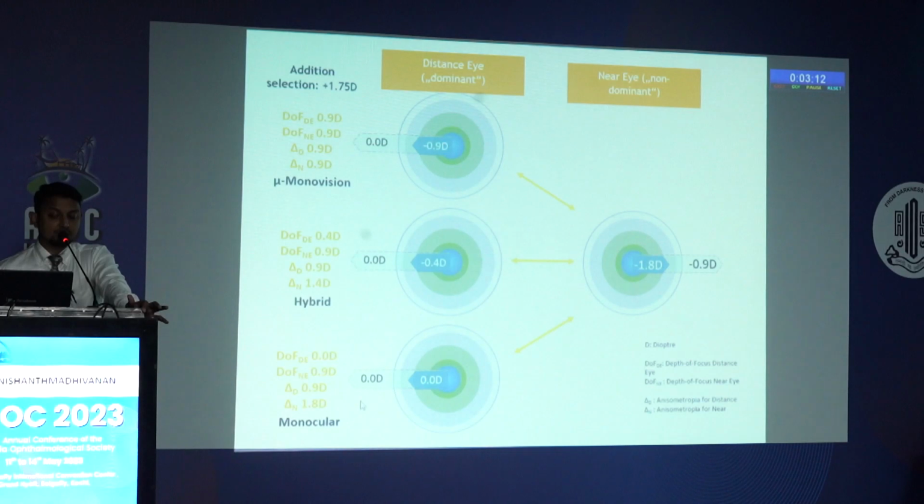And the monovision, we know how it works, where the distance is left plano and only the near we correct. So the only difference for monovision is that these are patients who are not having any distance myopia or hypermetropia.